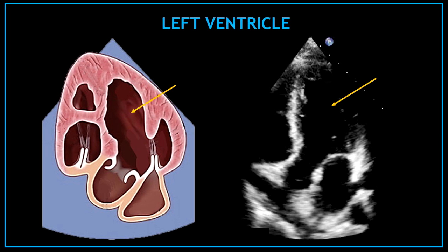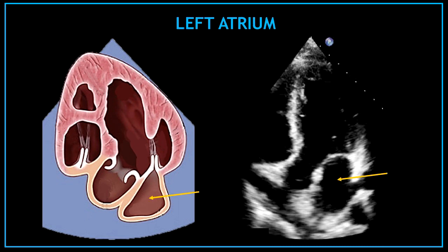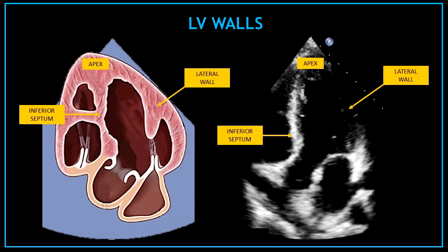The first big chamber at the top of the screen on your right hand side is the left ventricle. At the left of the left ventricle, that top chamber we can visualize there, it's the right ventricle. Under the left ventricle, that rounded chamber, it's the left atrium. The left ventricle walls visualized in the apical 5 chamber view are the inferior septum in the middle and the lateral wall on the right hand side. At the top, we can also visualize the left ventricle apex.